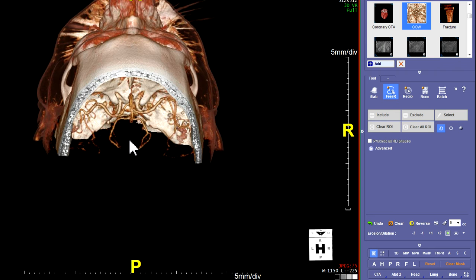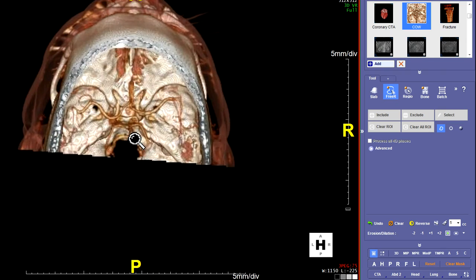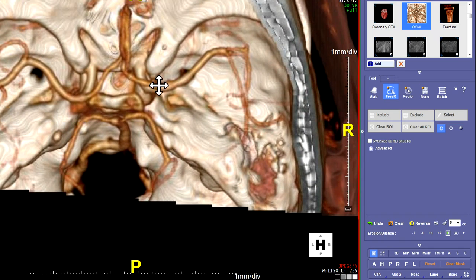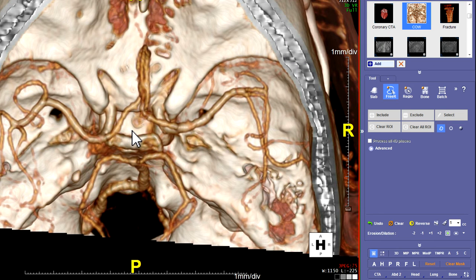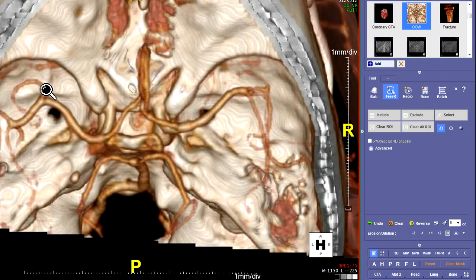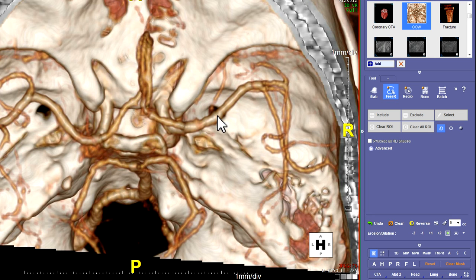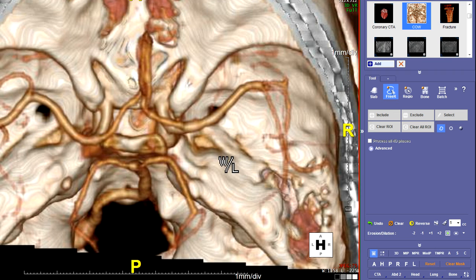Now you should be ready to make the films — make a series. Go to the head view to start. Do head view and then zoom it up: click the magnifying tool, move it, zoom it up until it fills the whole screen. For these 3D batch images, they actually shrink it a little bit, so zoom it really big, as big as you can get it. The window is pretty good just using that COW template window, but try to tweak it. Look at the middle cerebral artery and make it have a nice shiny white, clear and smooth — just tweak the window to make it as clear as possible.